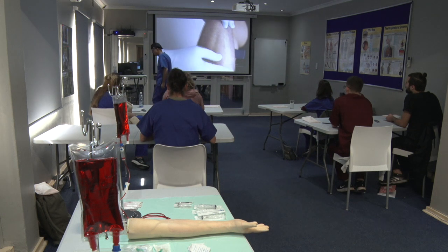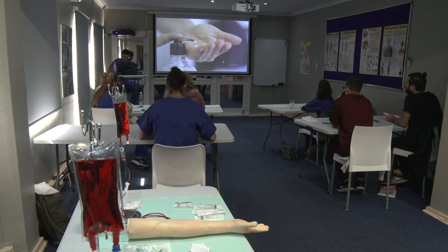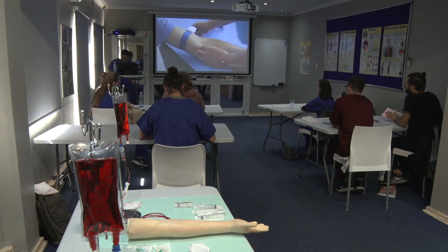During a venipuncture skills workshop, the instructor will cover the basic theory, show a number of case studies, and then follow with a number of practical demonstrations to lay a solid foundation.